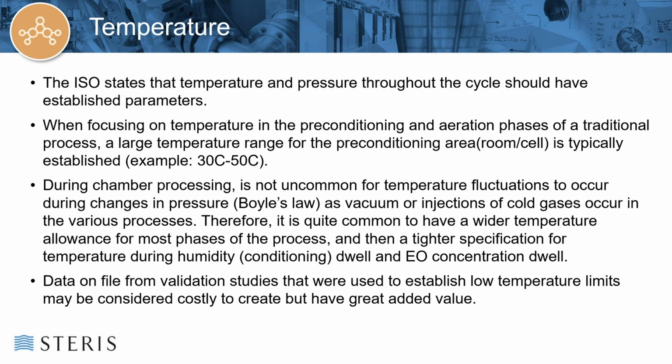If you have all in one, then obviously all your temperature is going to be required at different phases when the product is in the chamber. If you have a three-step process, the preconditioning and aeration phases usually have a pretty big range of temperature that's used. So you want to try to test those areas in the coldest spots. Typically, you don't worry about the hottest spots because the coldest spot is the biggest challenge. So generating data at the coldest spot within the aeration room when you're testing residuals, and then in the coldest spot in the preconditioning room before you're going into lethality is the best way to look at generating data to support your upper and lower ends.